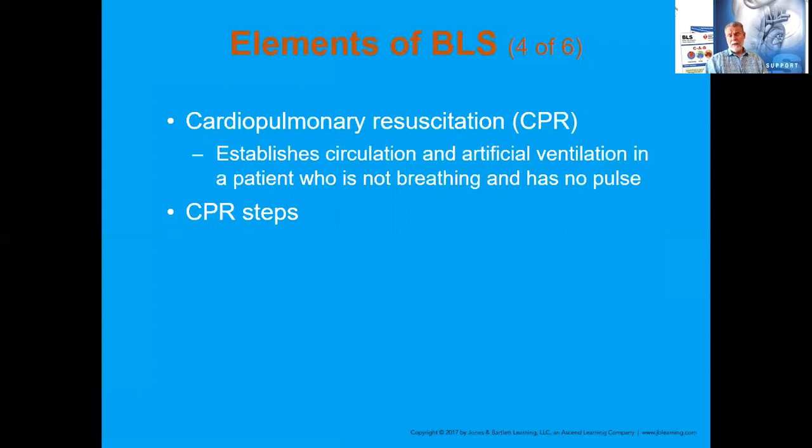It is possible to do that with a bag valve mask, which gets you close to 100% oxygen. If it's a mouth to mask with a face shield and you have that supplemental oxygen port, then you're more likely to get about 55% oxygen to the patient. When you're breathing in via mouth to mouth, then that's about 16% oxygen.